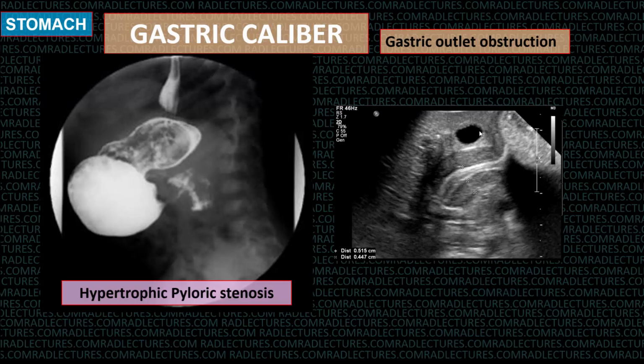That is how the liver is divided into the right and left lobes, by a plane passing through the middle hepatic vein and the gallbladder fossa. Once you have found the gallbladder, if you go a little lower, you should be able to find the pylorus.